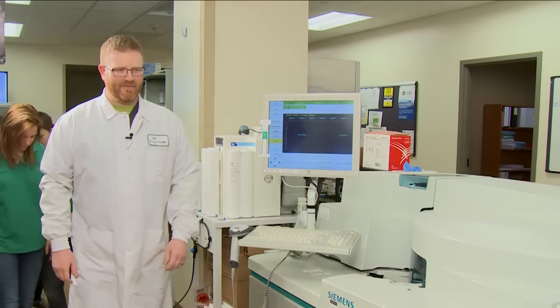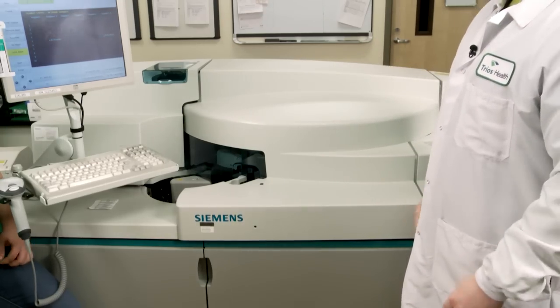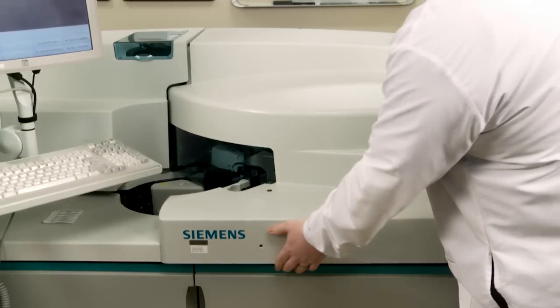So those are a bunch of great questions, but I was wondering if you guys would like to see some of the equipment we use here in the lab. Yeah! We use a lot of different equipment in the lab. This analyzer here is our main chemistry analyzer — this is where we run those electrolyte tests, the liver and kidney tests, and the glucose tests. They're all done on this analyzer and it has lots of moving parts inside.